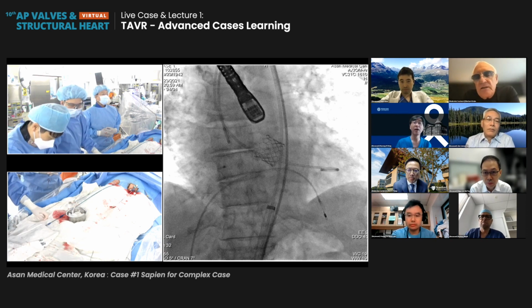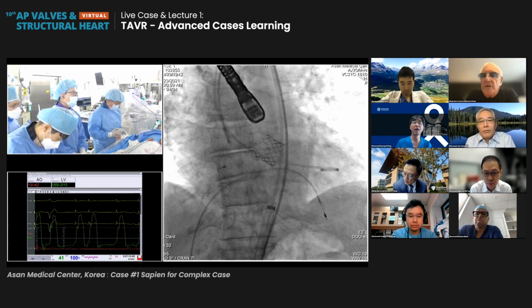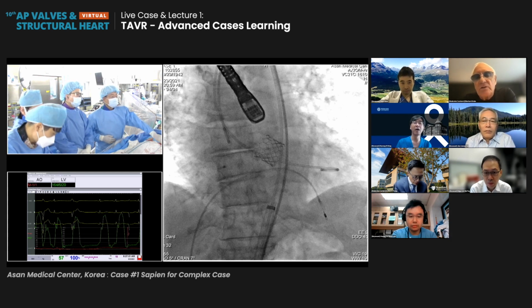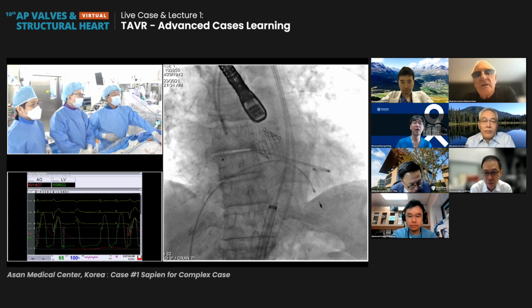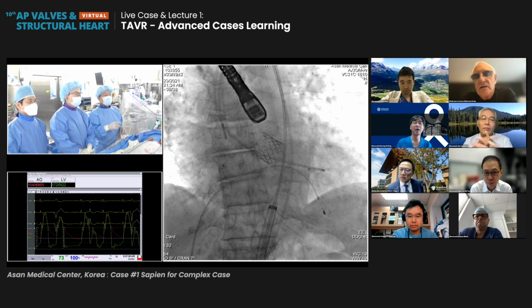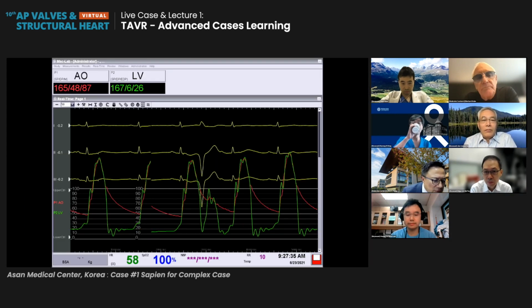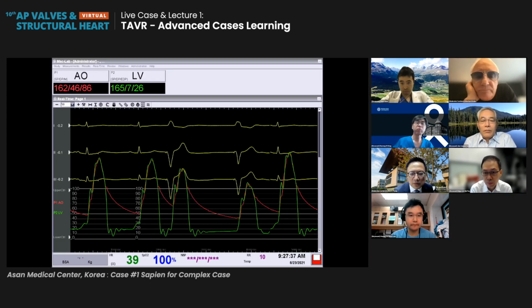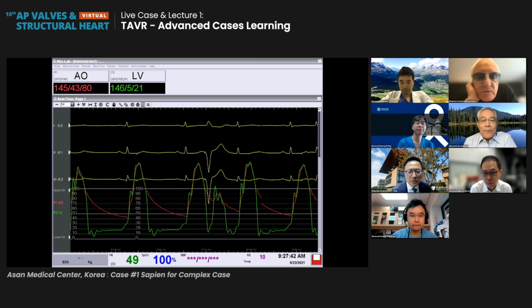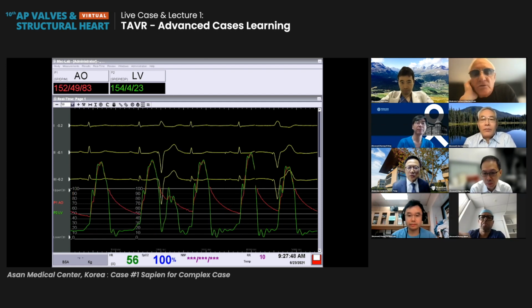But you know, I think what we see here is something that is probably doable in an old patient. In a younger patient, I would agree, I would not put a 20 S3 into a younger patient. Okay, would you show us the pressure monitoring on the screen? Okay, great. With an old patient, no gradient, mostly. Yeah. All right. Maybe some, the gradient is okay. I think it's totally reasonable in an 80-year-old to do that.